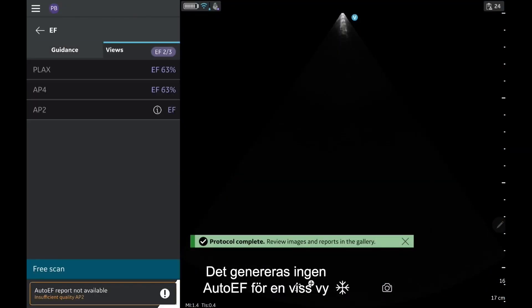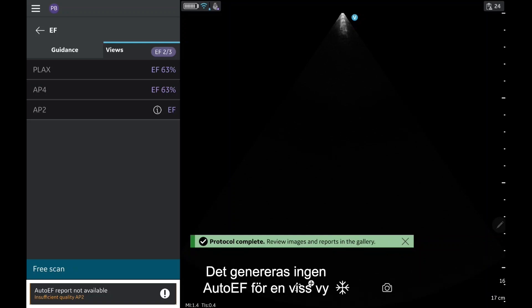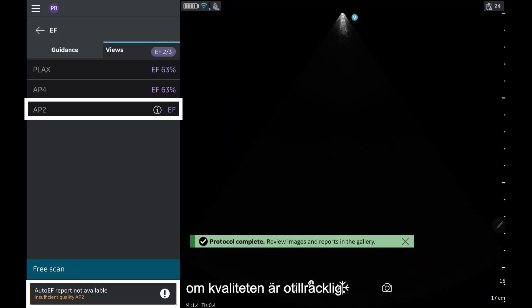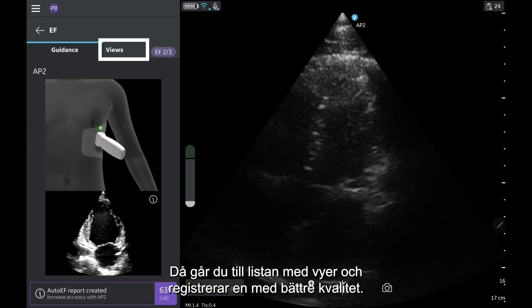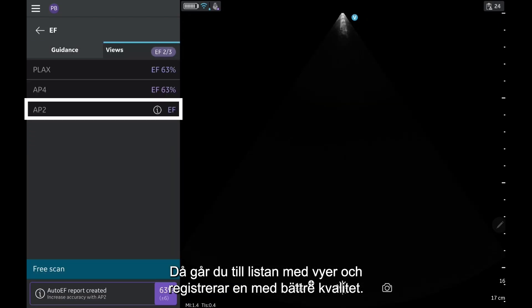An auto-EF will not be produced on a specific view if it is not of sufficient quality. If this is the case, go to your Views list and try to record a better quality view.